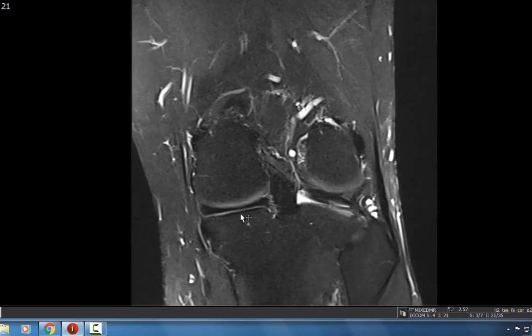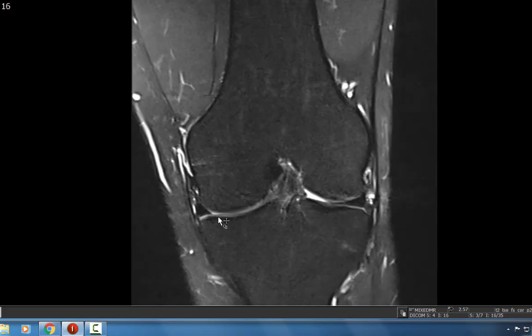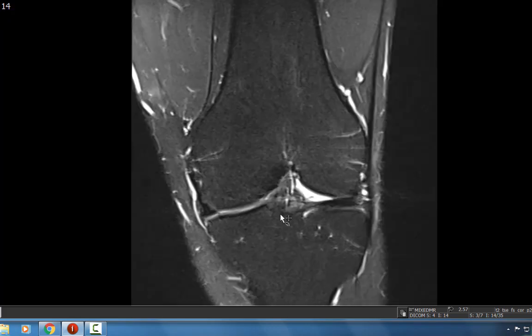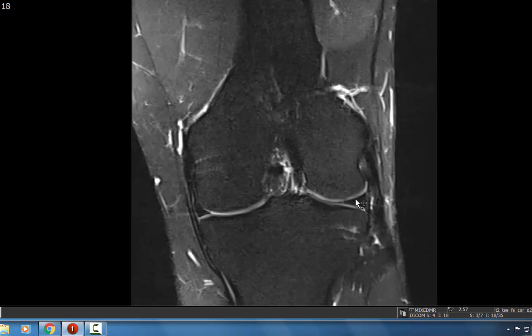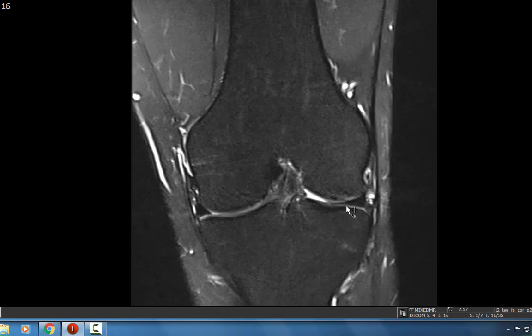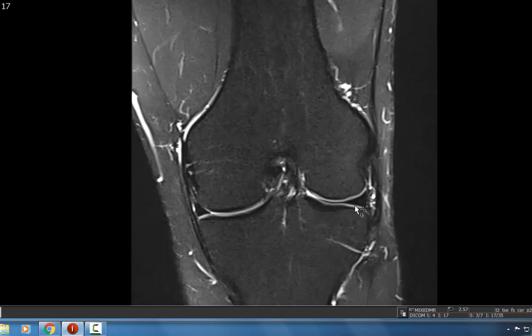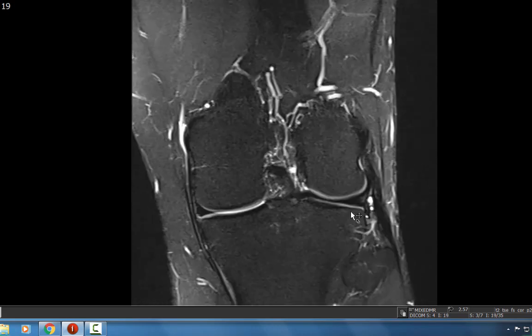We see no focal chondral defects within the medial femoral tibial compartment of the knee. Turning laterally to look at the articular cartilage, it's nice and gray and intermediate in signal intensity. There's no T2 hyper-intense signal to suggest a partial thickness or full thickness chondral defect about the lateral femoral tibial compartment of the knee.